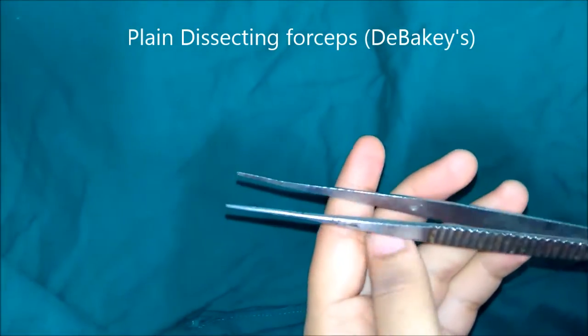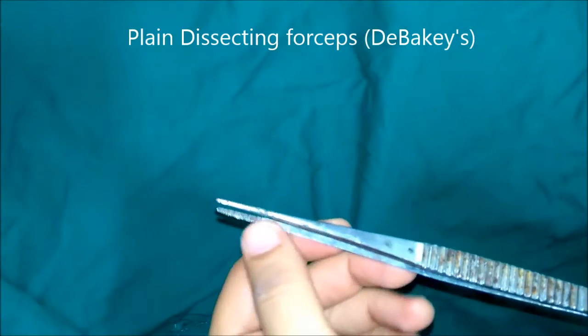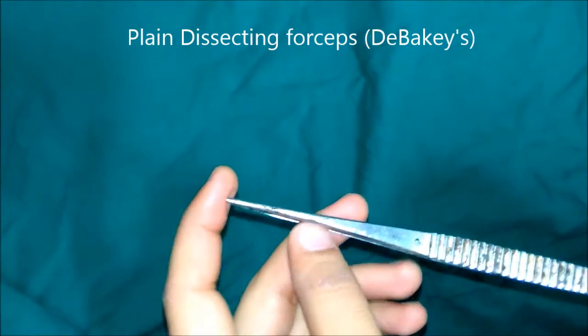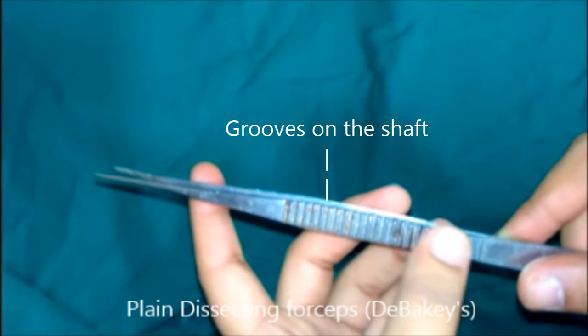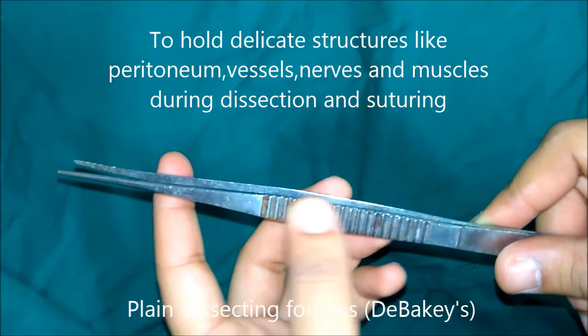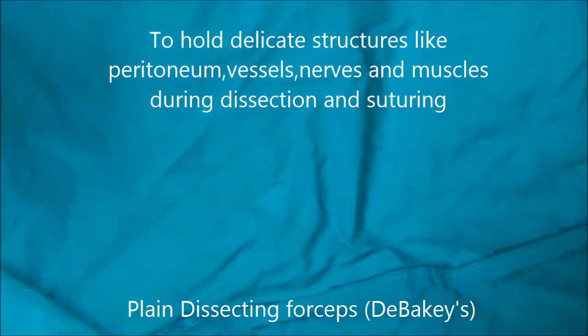These are DeBakey's plane dissecting forceps. They have transverse serrations at the tip of the blades which helps in lifting the tissue and needle during suturing. There are also grooves on the shaft of the instrument which allow easy gripping. This is used in almost all operations to hold delicate structures like peritoneum, vessels, nerves, and muscles during dissection and suturing.